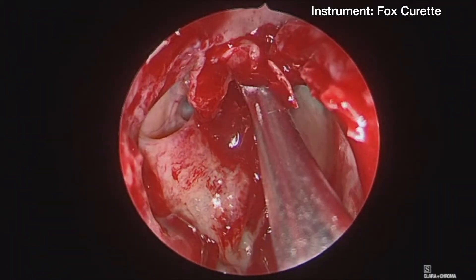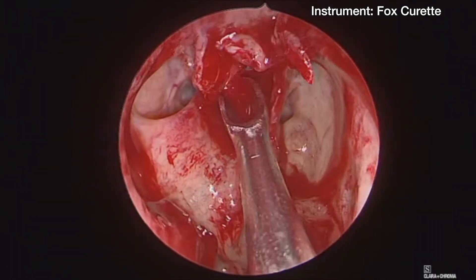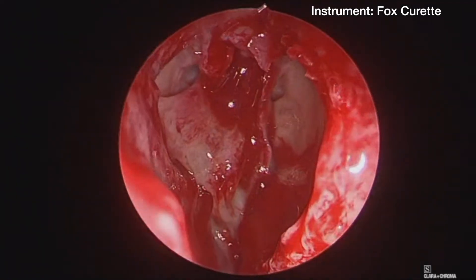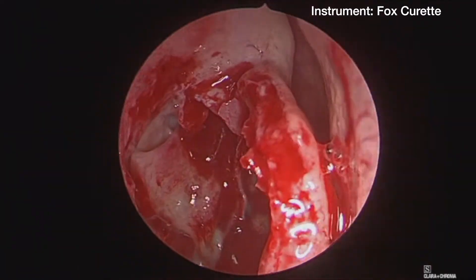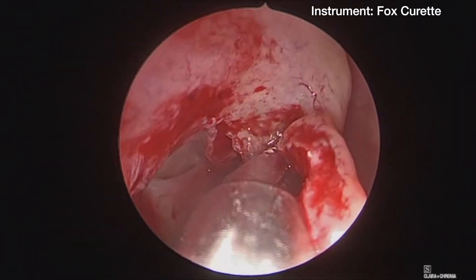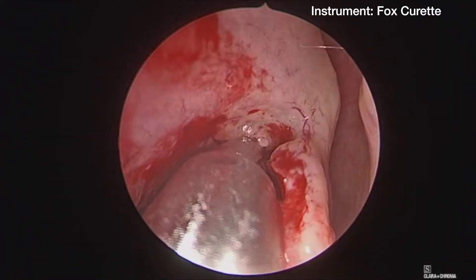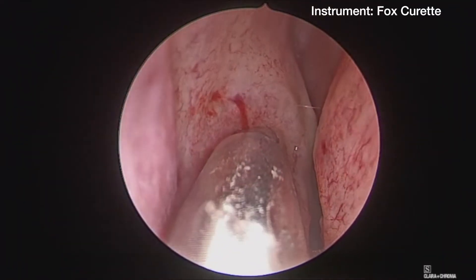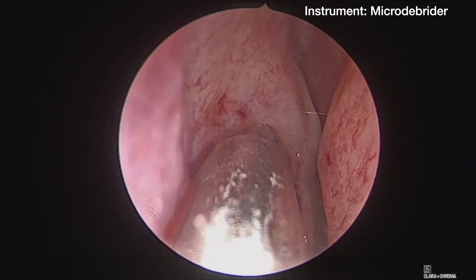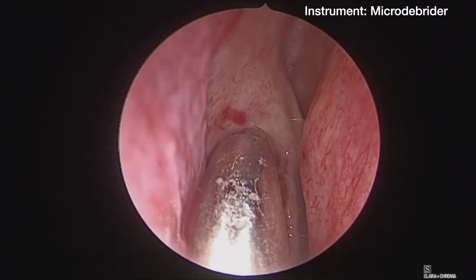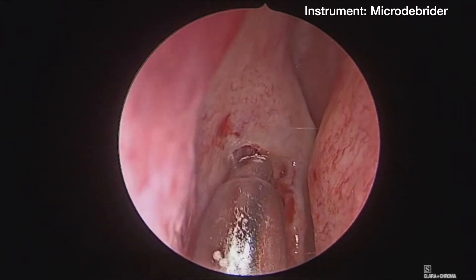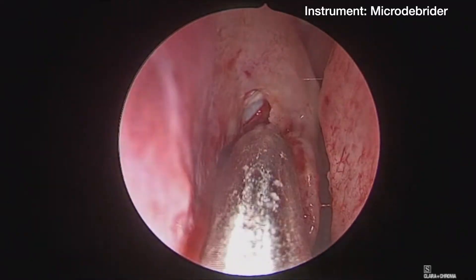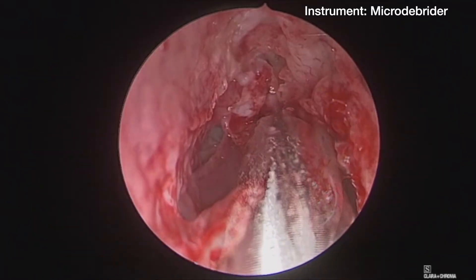The agger nasi cell was then collapsed forward anteriorly with the fox curette. This is a safer maneuver than applying pressure posteriorly, as the only thing anterior is the beak area, which is quite solid bone. The frontal sinus outflow tract is then expanded further with the microdebrider.